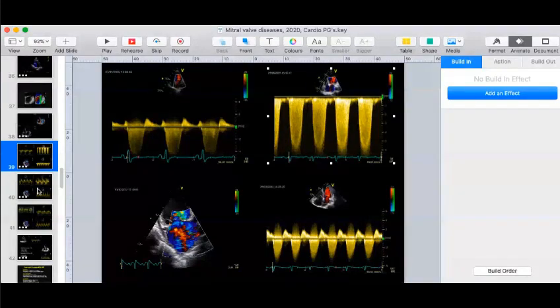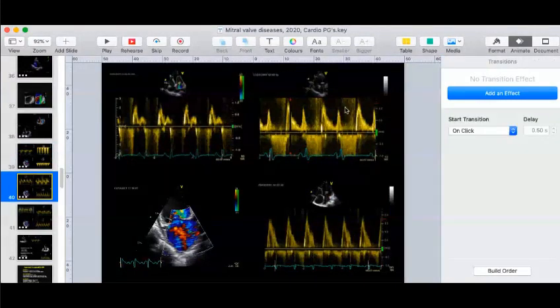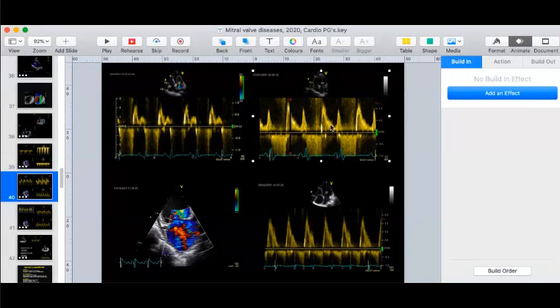Now, the next parameter I'm going to move to is pulse Doppler. So what does this pulse Doppler indicate here? Let me focus only on this. Between the top image and the bottom image, which is more severe? Ignore this image. The bottom image is more severe. Why do you say that? You are correct, increased E velocities. Here the cutoff is 1.2 to 1.5 meters.